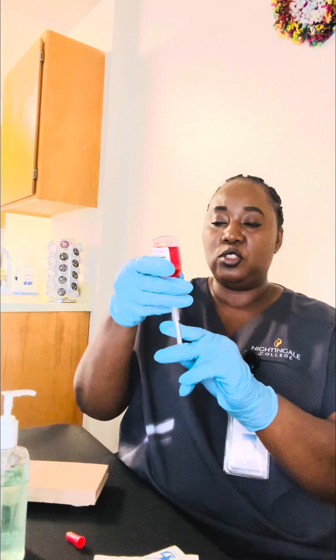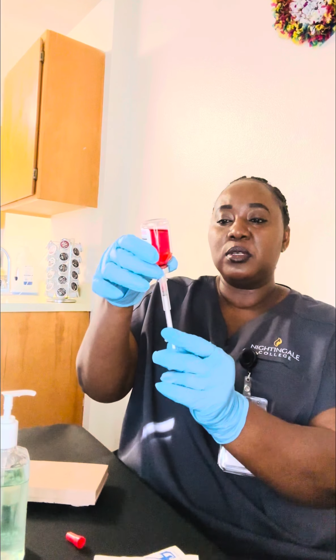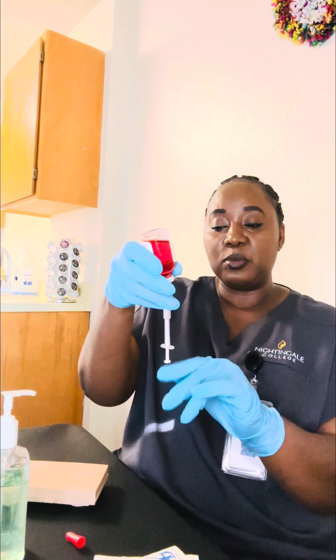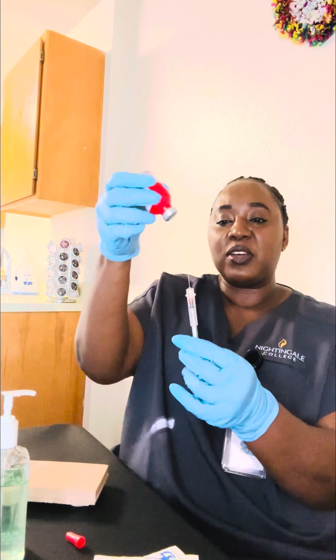Flip the medication, turn the vial over inversely, and then draw up the 0.1 ml. If there are bubbles, I'm going to tap. If I still want the bubble to be pushed up, I'm going to flick from the bottom to push the bubble up. Once I have the injection, I'm going to remove the vial gently without bending the needle, and then I'm going to do one-hand scoop to recap it.